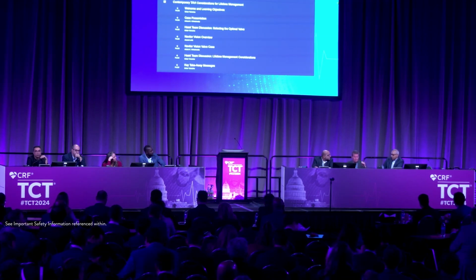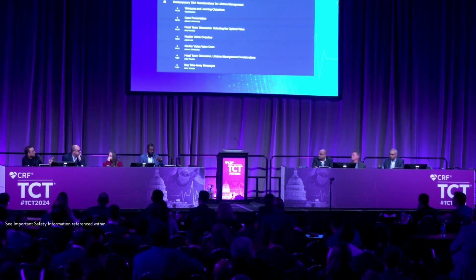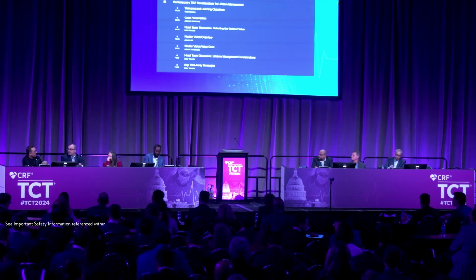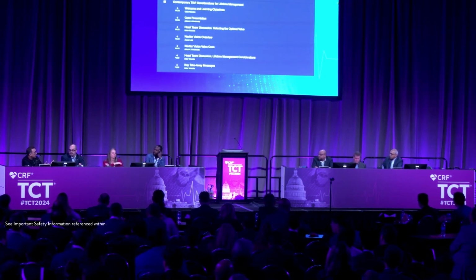But what I would say is that if this patient had no option, and for whatever reason you think transcatheter valve was not an option for him, then we would operate on him. But shouldn't that be the right discussion, rather than "is he a surgical candidate?" Shouldn't the right discussion be, at 80, is he a good TAVR candidate? That's exactly right. If he's not a good TAVR candidate, then are there other options, which could include surgery?